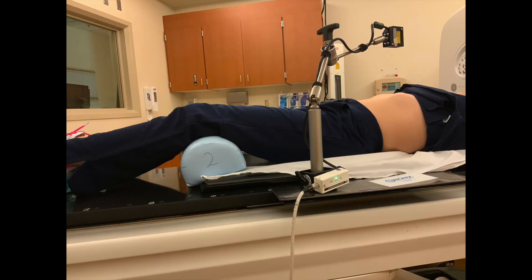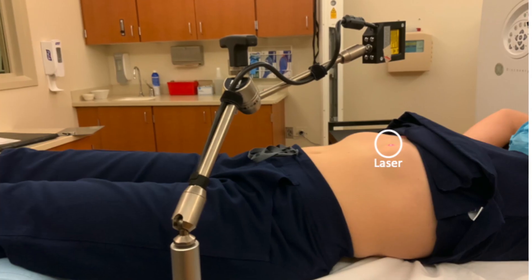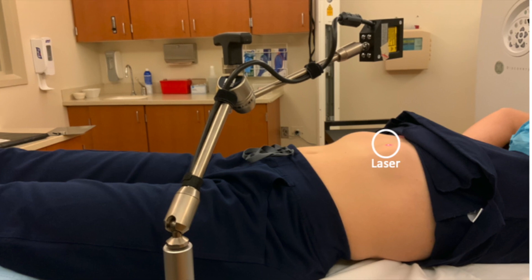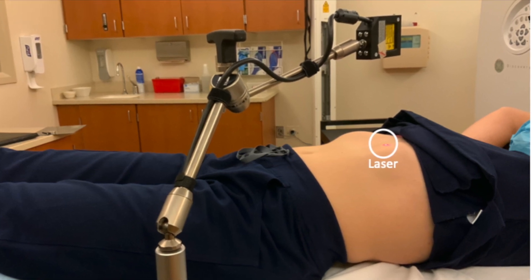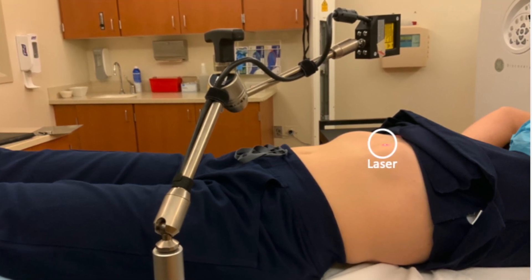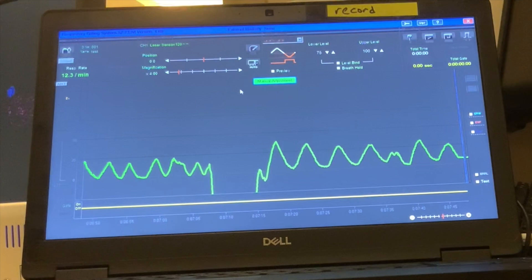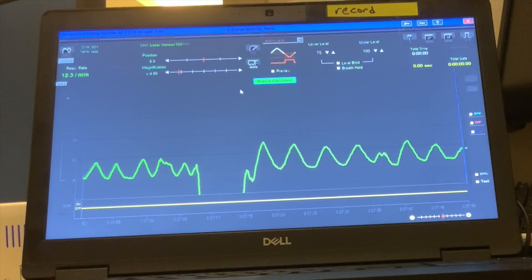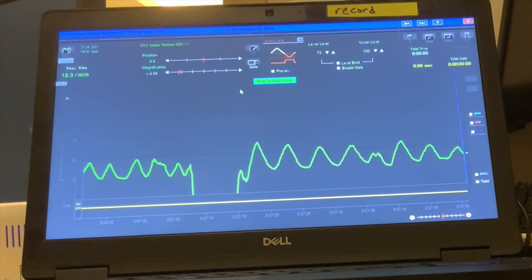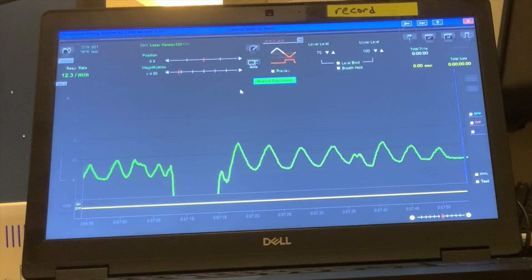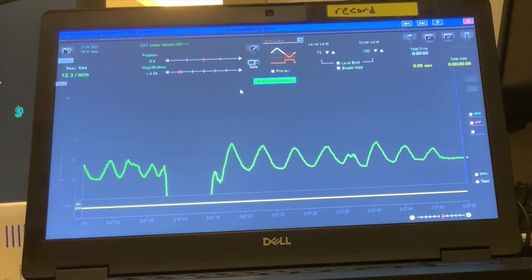The ANSI breath hold system will track your breathing pattern by using a laser that shines onto a specific point on your body, somewhere between your chest and belly button. Your breathing pattern is shown on a computer that the radiation therapists monitor throughout your planning appointment and treatment.